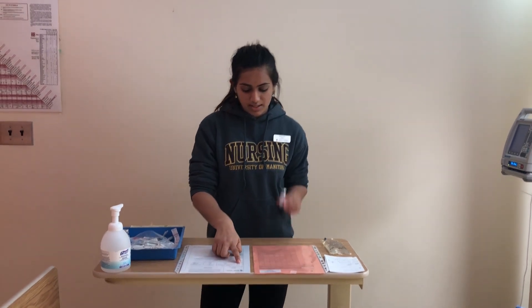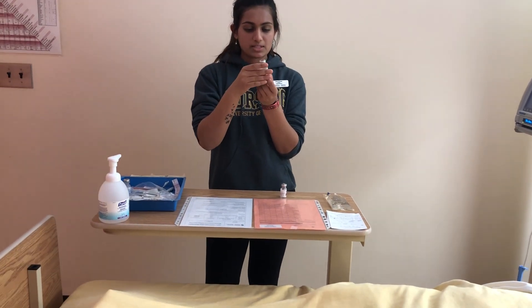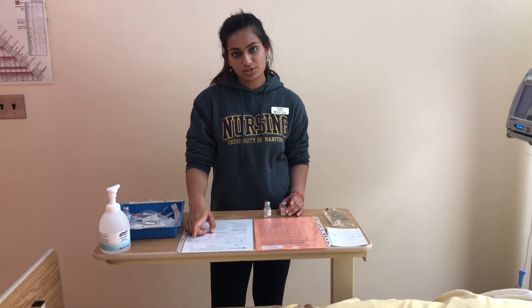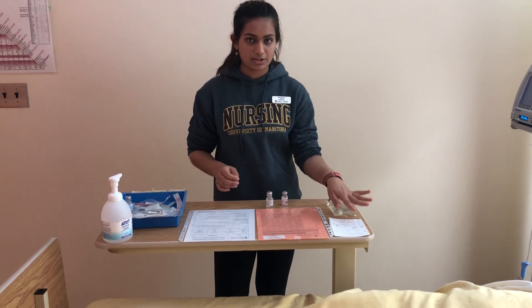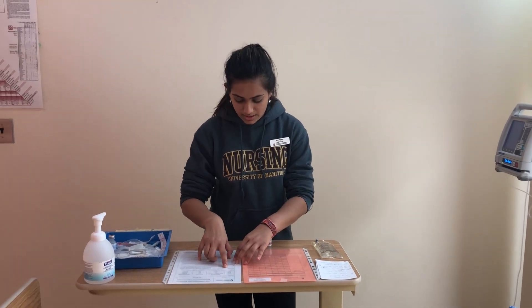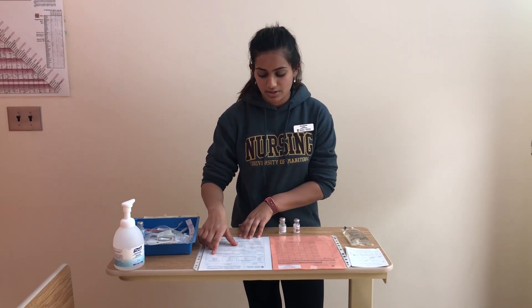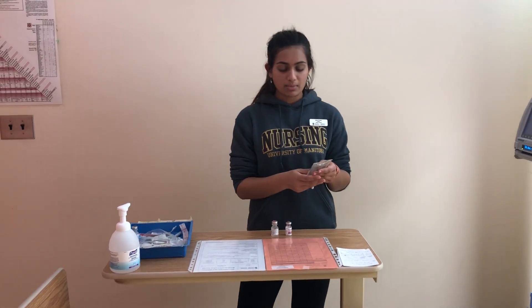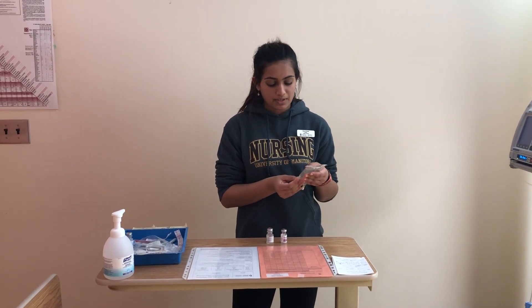I have a vial size of 125 milligrams, so I'll need to add two milliliters of sterile water — just checking that it's intact and not expired — and then I'll get a final volume of two milliliters. The concentration in that vial will be 62.5 milligrams per milliliter. The volume I'll need from this vial is 1.2 milliliters after doing the calculation. For IV intermittent, for doses less than 250 milligrams, after reconstitution dilute further in 50 to 100 milliliters of normal saline or D5W, and administer over 15 to 30 minutes.